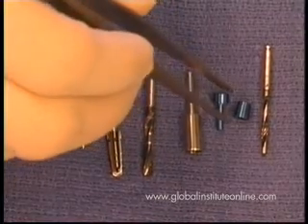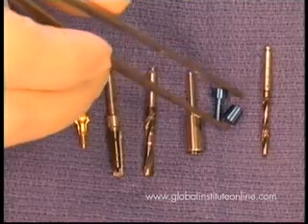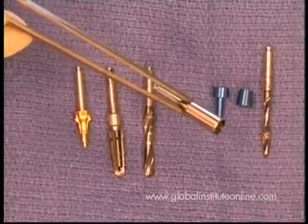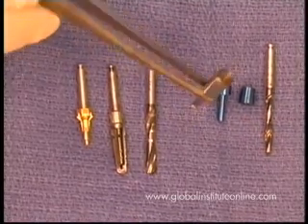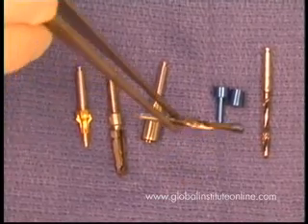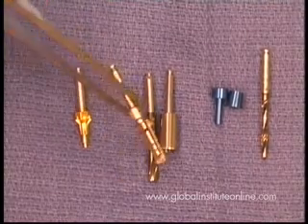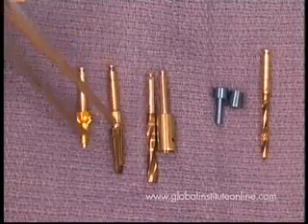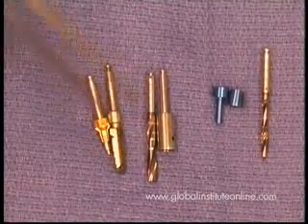As you can see here, the first drill is a 2 millimeter twist drill. Then we use a parallel pin to guide the punch over the parallel pin to excise precisely the gingiva for a flapless procedure. The following drills are just utilized to increase the dimension, and they follow the tapered Nobel replace drilling sequence with a final insertion tool to insert the implant.